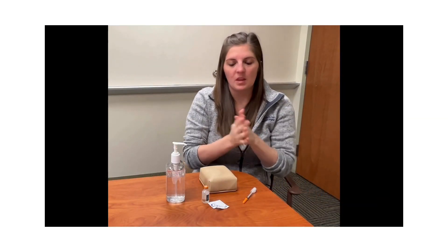First, you want to start by washing your hands. You can use soap and water or you can use hand sanitizer. If using hand sanitizer, make sure that the alcohol is dry on your hands before proceeding.